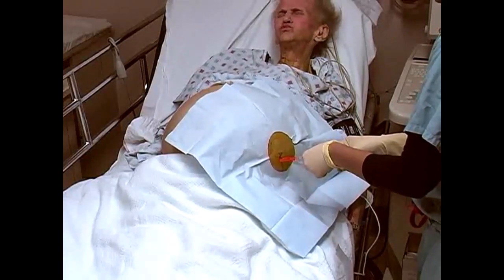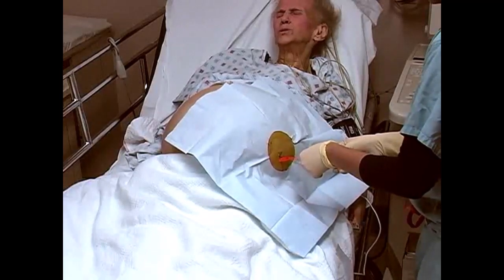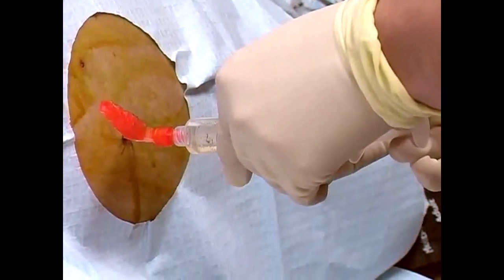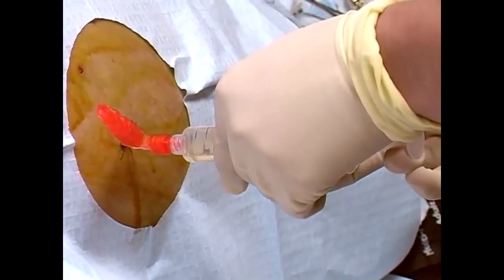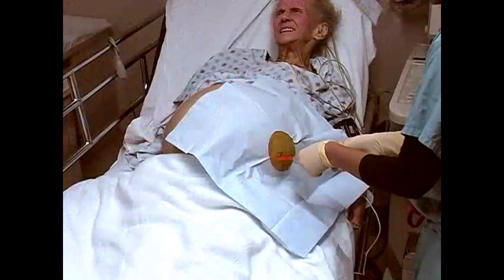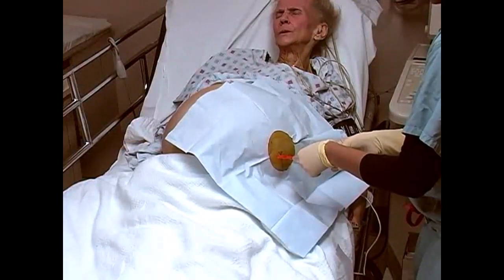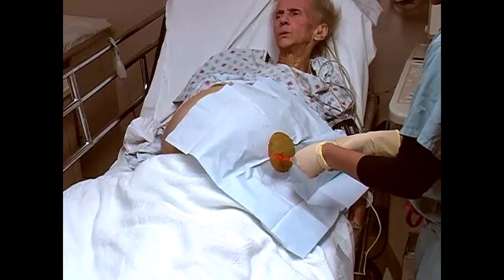Alternately inject anesthetic and pull back on the plunger during needle advancement. Entry into the peritoneal cavity is signaled by aspiration of ascitic fluid into the syringe. Inject additional anesthesia at this time to numb the highly sensitive parietal peritoneum.